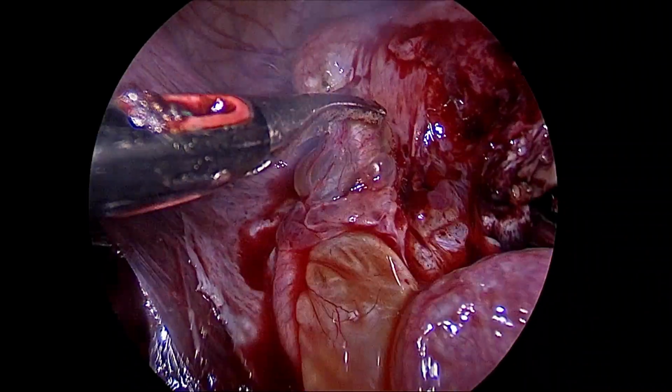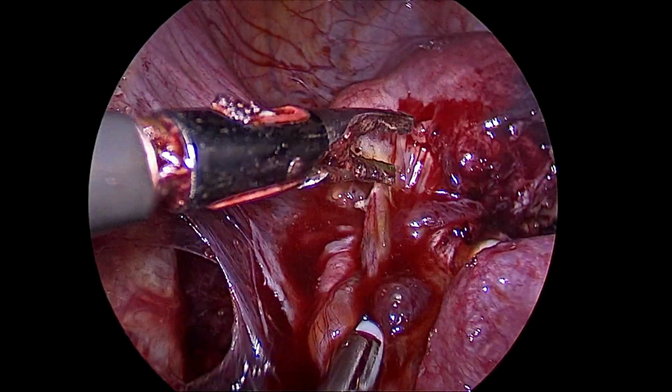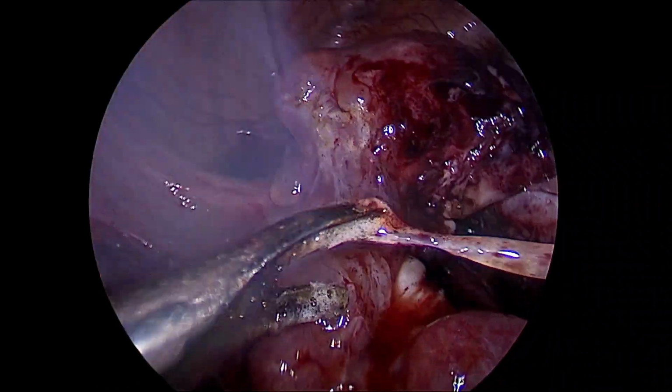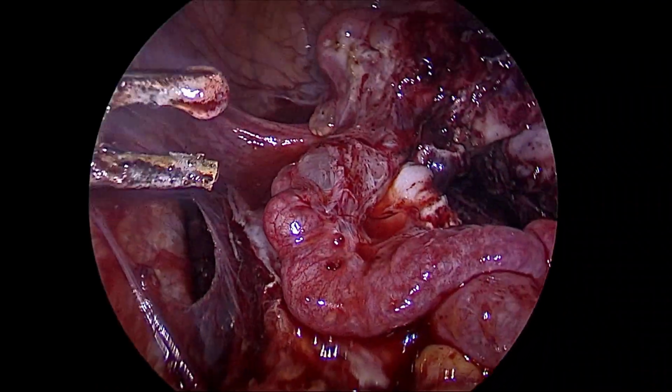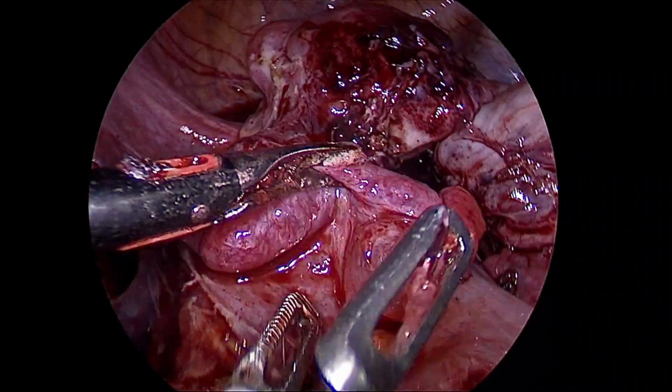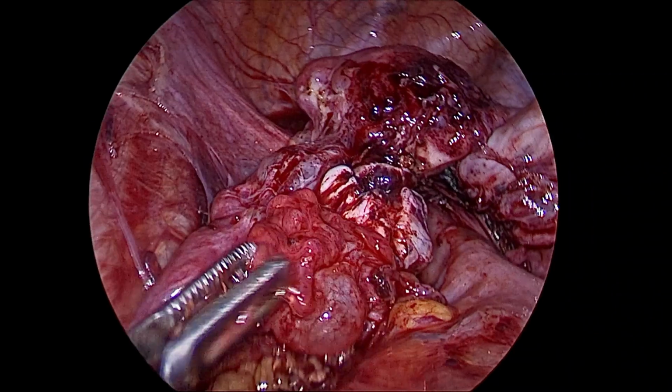As you can see, these are the peritoneal inclusion cysts which are there on the left side as well, though they are not as florid as on the right side, but it has been our effort to remove that as well, because these also have foci of endometriosis.